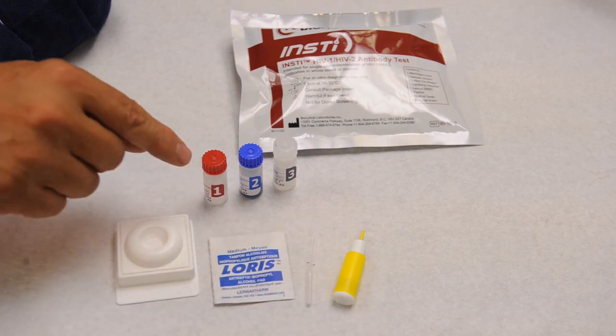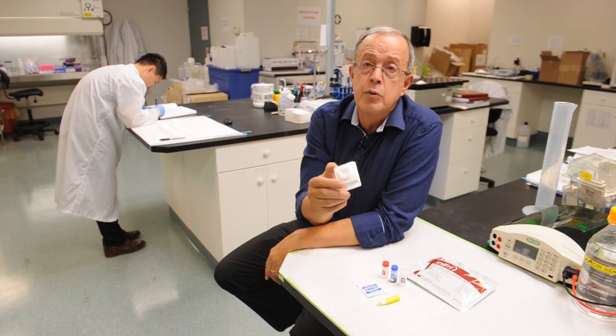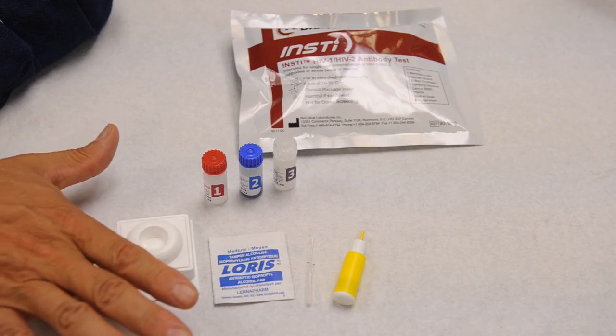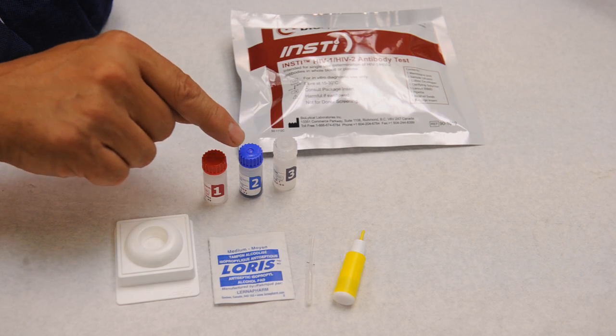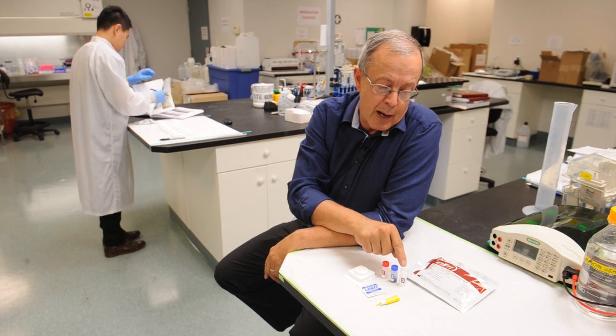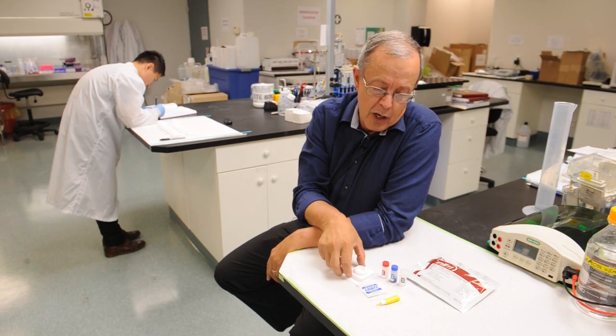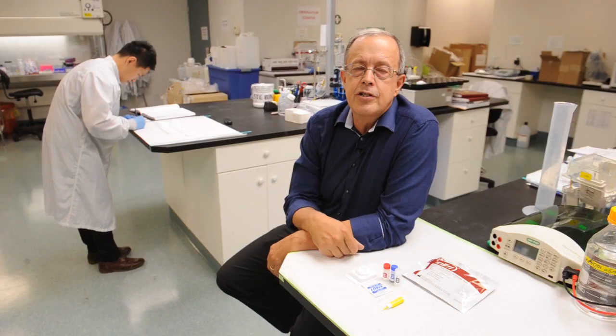After the blood is collected, it's added to Solution 1, mixed gently, poured into the membrane unit, and allowed to flow through for a few seconds, followed by Solution 2, which is your color indicator — that also flows through in a few seconds. The last step is to add the clarifying reagent, and the results are then ready for interpretation, all within 60 seconds.